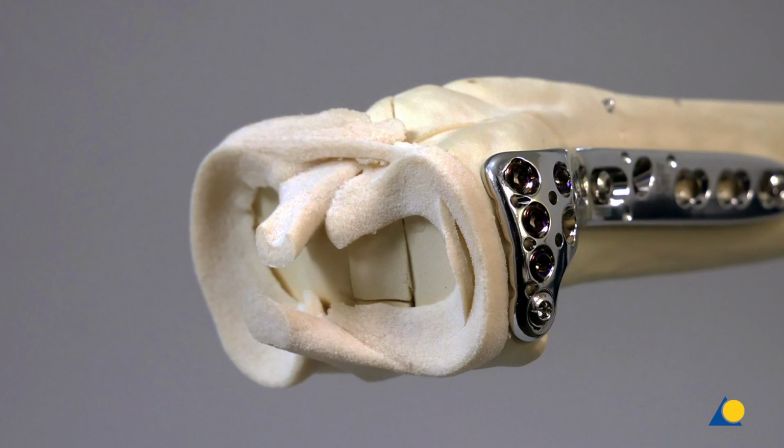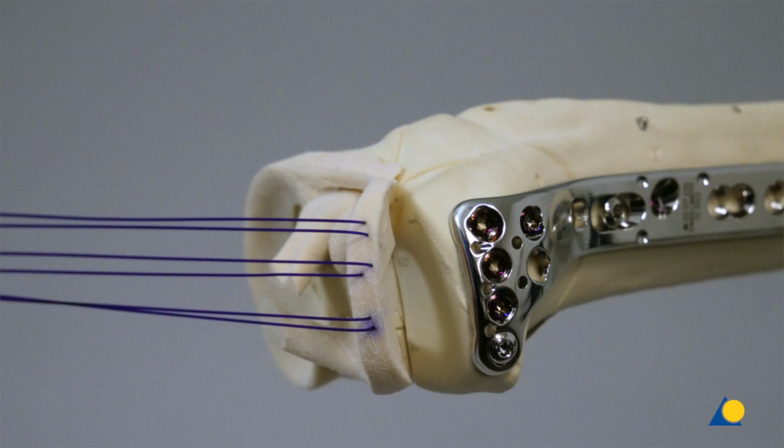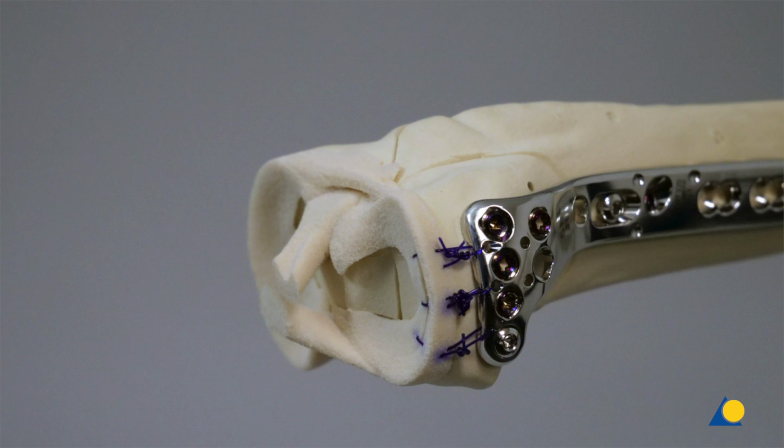In the clinical situation of a lateral bucket handle tear of the meniscus, the tear could now be repaired before continuing with the procedure. Shown is a lateral bucket handle tear of the meniscus. The bucket handle tear in the rim of the meniscus has been corrected with 3 reabsorbable sutures. Observe that the proximal end of the VA LCP tibial plate has 3 holes, which can be used for both provisional K-wire fixation and sutures. The sutures correcting the tear of the meniscus have been threaded through the most proximal K-wire or suture holes of the plate and then tightened.